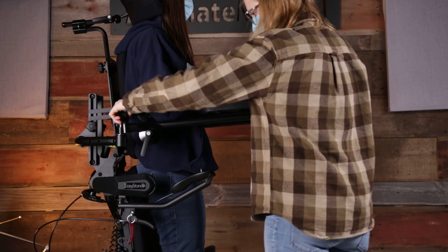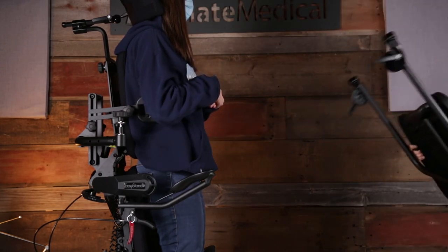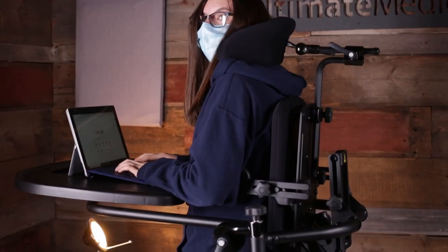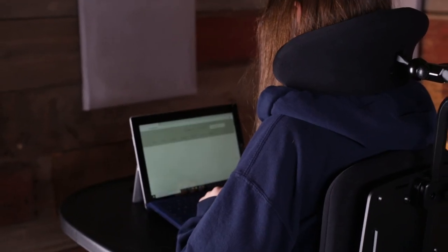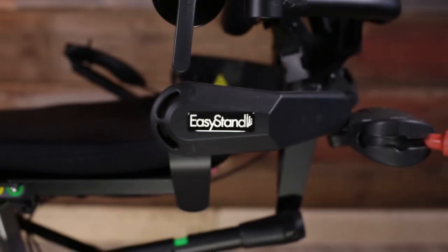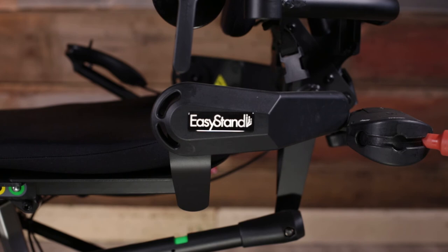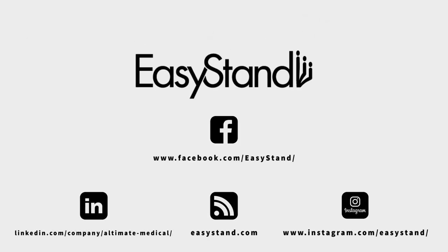The swing-away tray can also be removed completely by loosening the knobs on both sides for full frontal access. With a tray size of 21 by 24 inches, it provides ample space for work or play. For more information about the Bantam Medium or to schedule your free product demonstration, go to easystand.com.